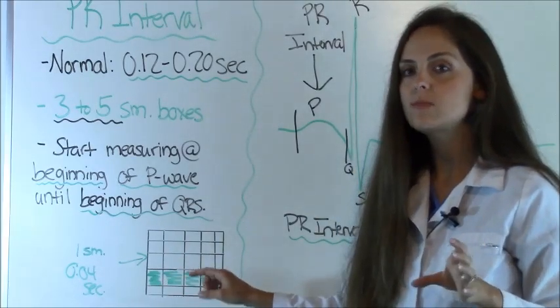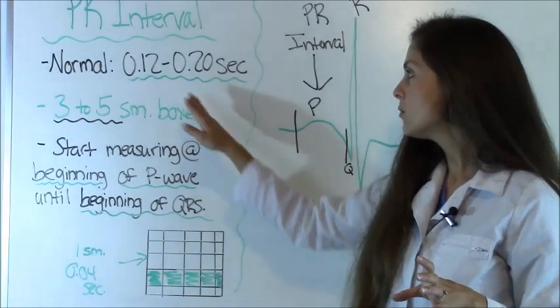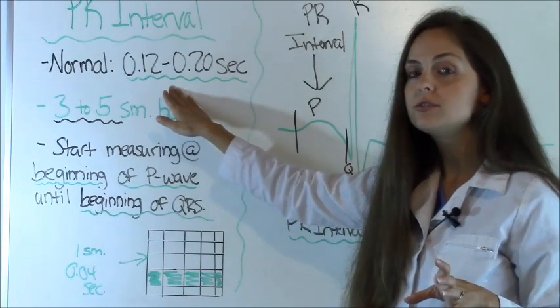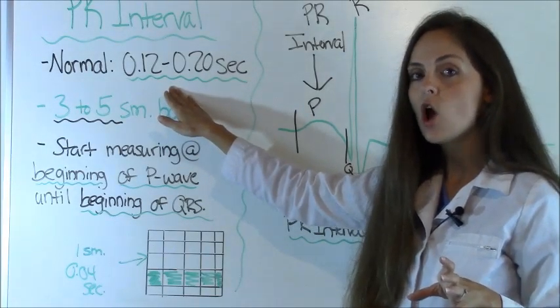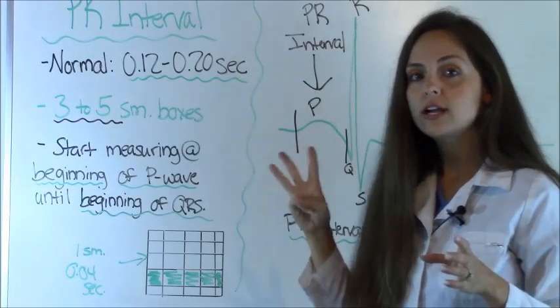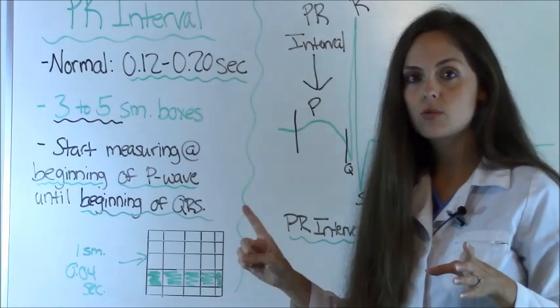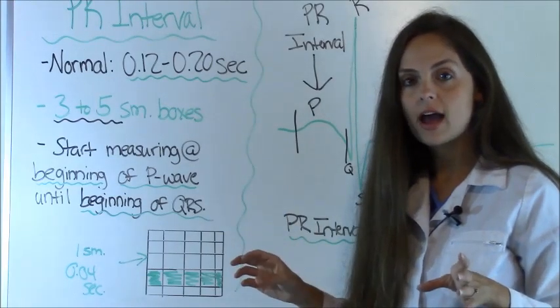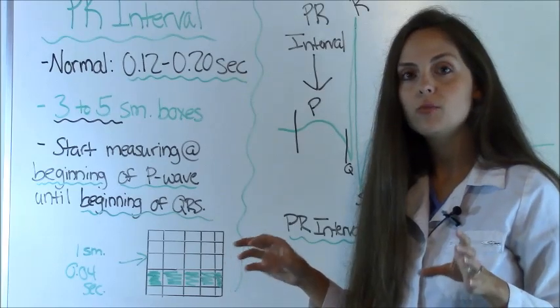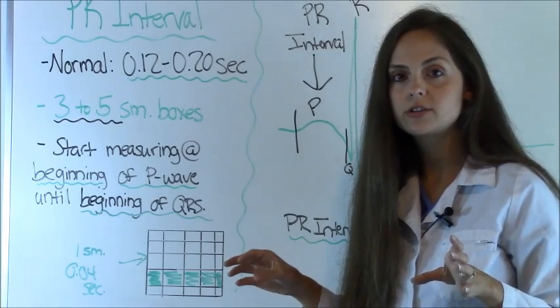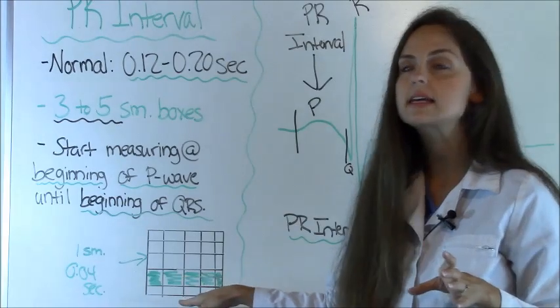You want to pay attention to the small squares. And a normal PR interval, as we said, is 0.12 to 0.20 seconds, which represents 3 to 5 small squares. So when you're measuring that, which we'll do a little bit later, you want to make sure that your PR interval measures within 3 to 5 small squares like this.